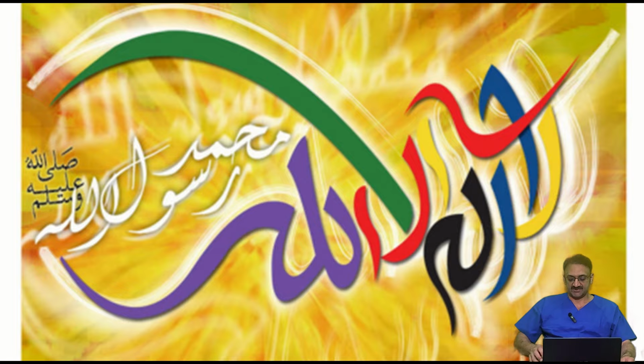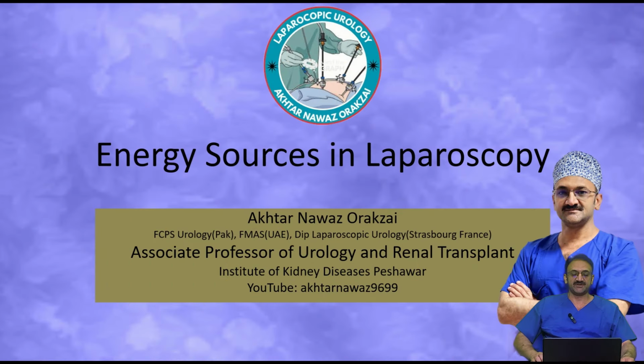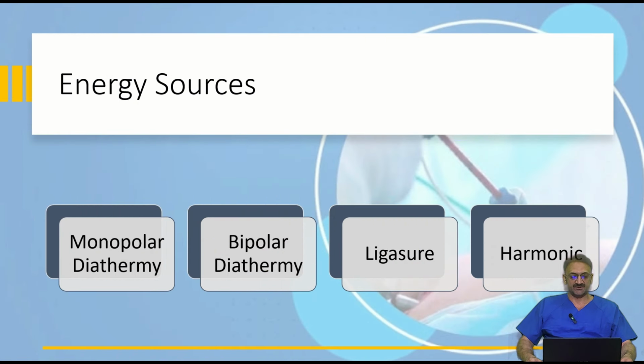Today we'll be discussing the energy sources in laparoscopy. So let's begin with the talk here. The energy sources are the sources or the instruments that are used to cut the tissue, to coagulate the tissue, and so on. These can be categorized into monopolar diathermy, bipolar diathermy, LigaSure and harmonic.